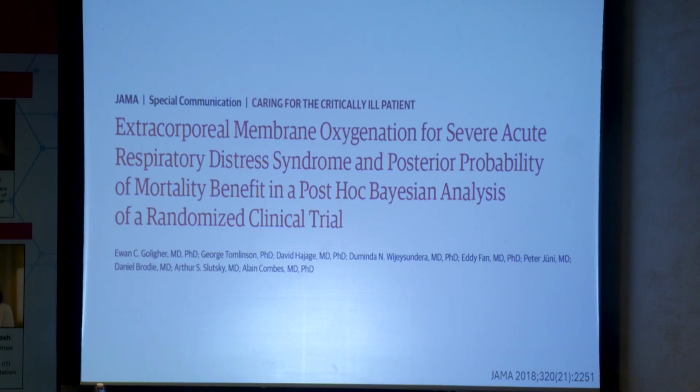Basically, the trend towards decreased mortality combined with the Bayesian analysis has led organizations like ATS to put ECMO as a conditional recommendation in their ARDS guidelines. And I don't think, tell me if you feel otherwise, that we're going to see another big trial of ECMO versus non-ECMO at this point. I think we have enough out there suggestive of a benefit.